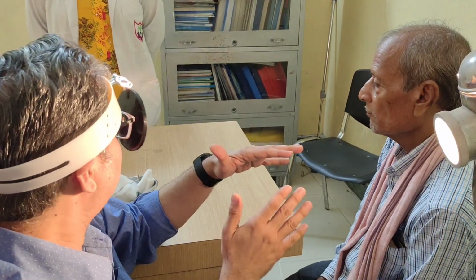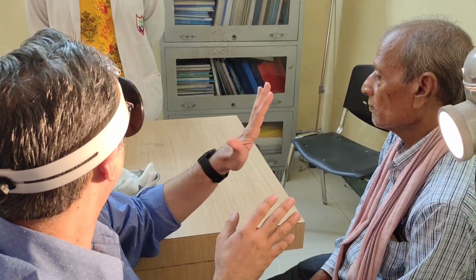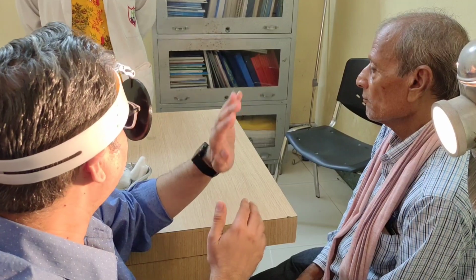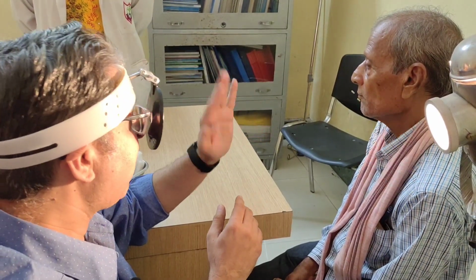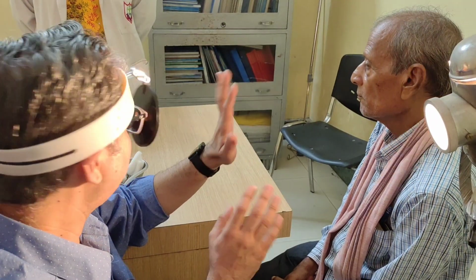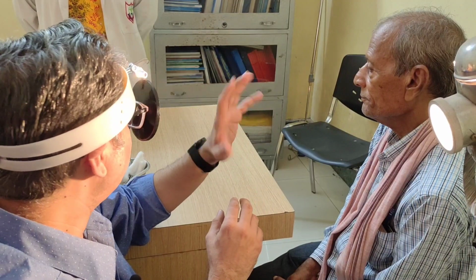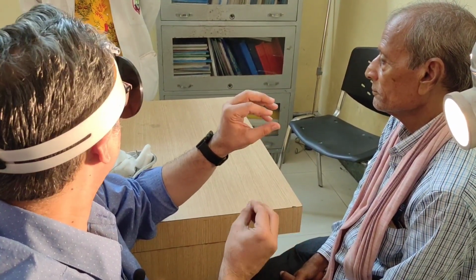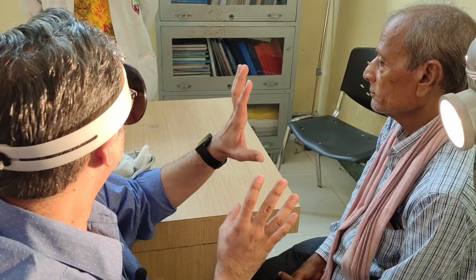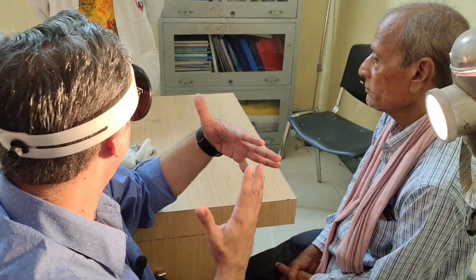Next is the color of the tympanic membrane. It is pearly gray in color, which is normal. It can be reddened in cases of acute otitis media. It can give a waxed appearance in cases of secretory otitis media, or it can give a bluish hue in cases of hemotympanum or glomus jugulare, right? So these are the common colorations of the tympanic membrane.